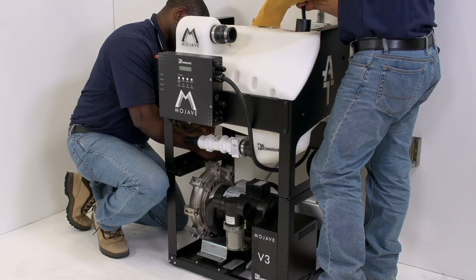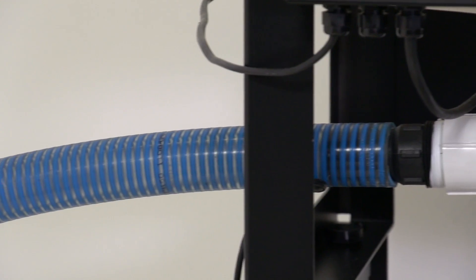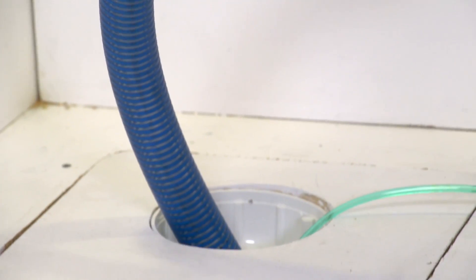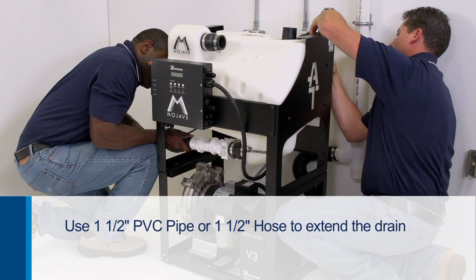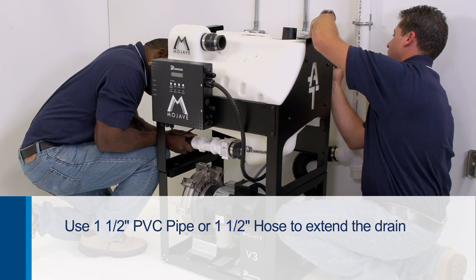Once everything is in place, one installer should work to connect the 1½-inch blue hose to the open floor or vented pipe drain. If there is a long run to the drain, you can use 1½-inch PVC pipe or purchase additional lengths of 1½-inch hose.